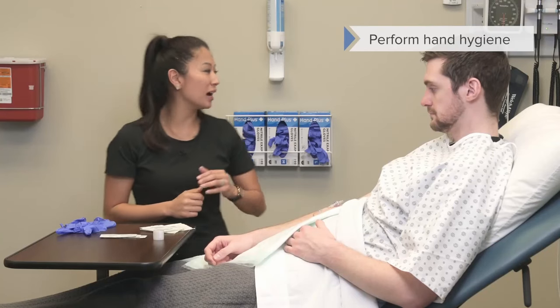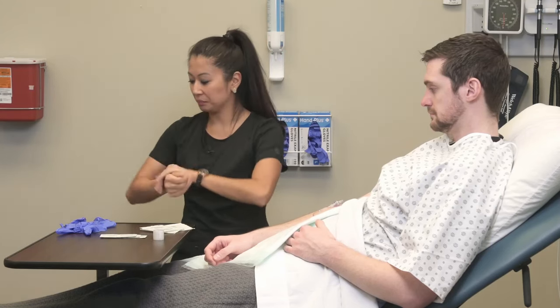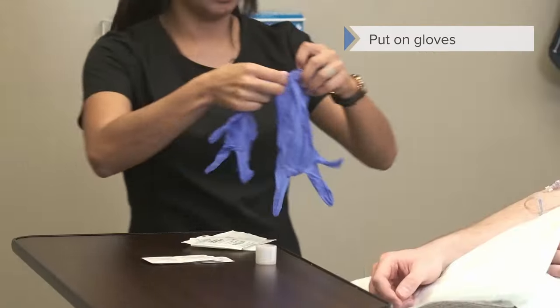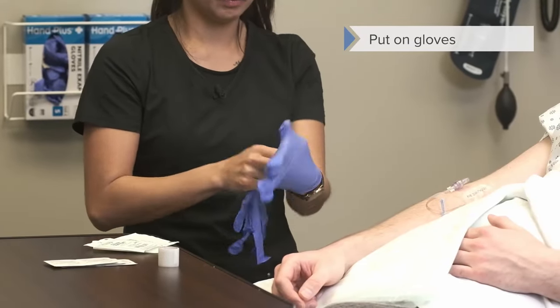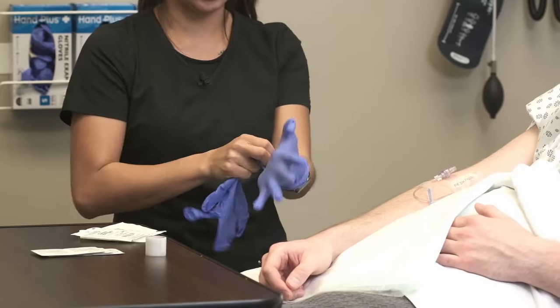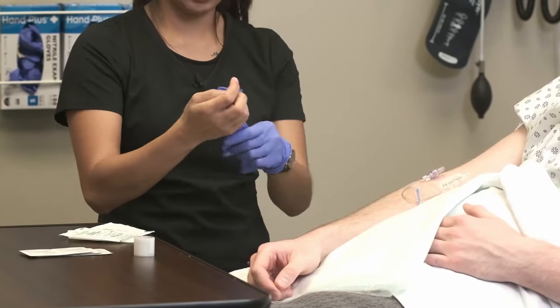Now I'm going to perform my hand hygiene, and then after this we're going to put on our gloves. Sometimes with hand sanitizer it can make the gloves stick a little.